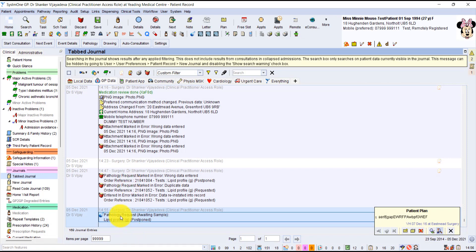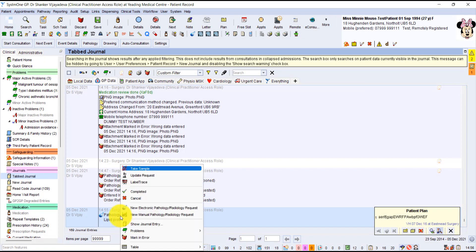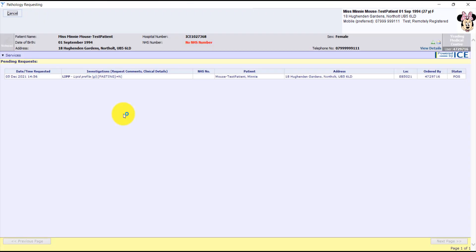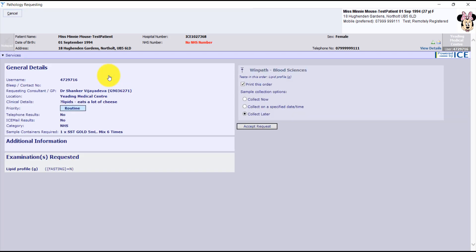But actually, when she attends for the blood test, we right click on it and we say take sample. So when we take sample, we click on the test that we want to take the sample for. So that's the cholesterol test.